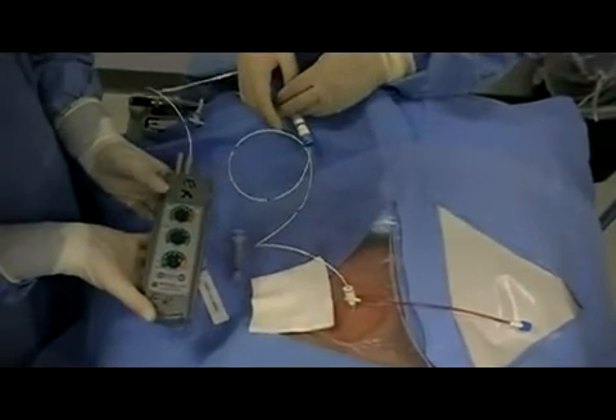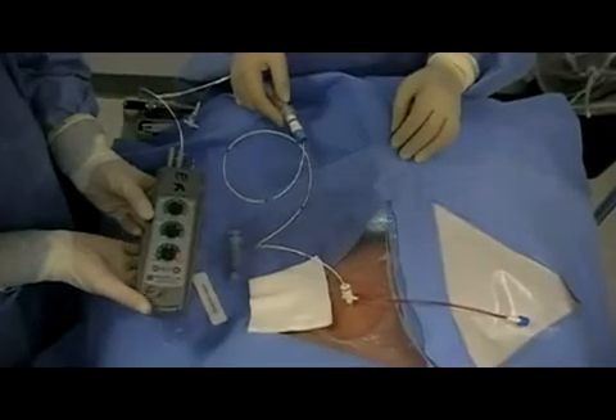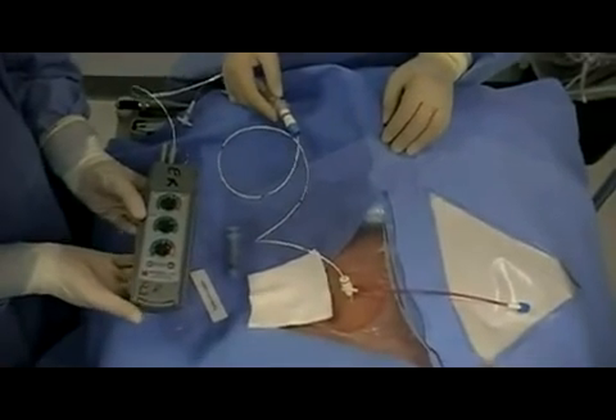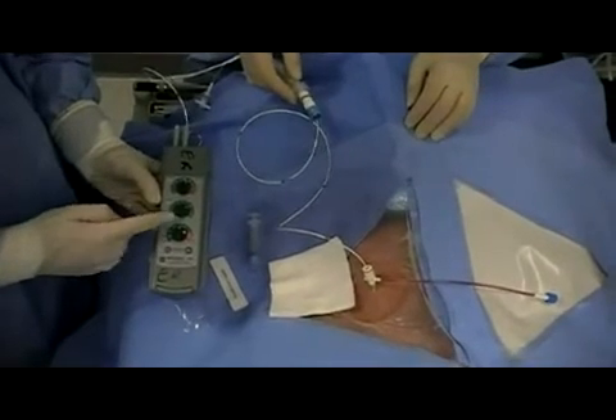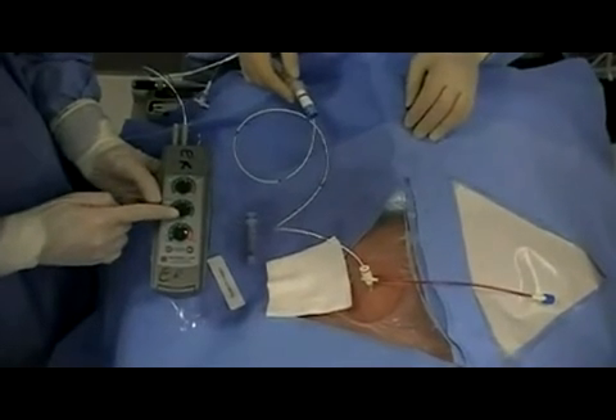The rate should be at least as high or higher than the patient's innate rate. As the catheter is advanced, watch the monitor for pacer spikes.